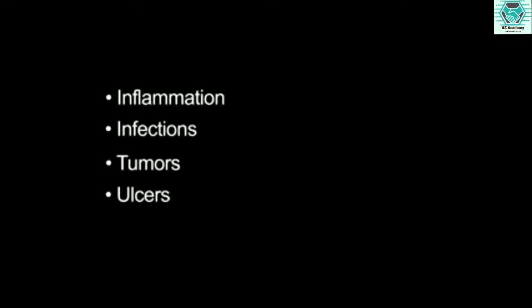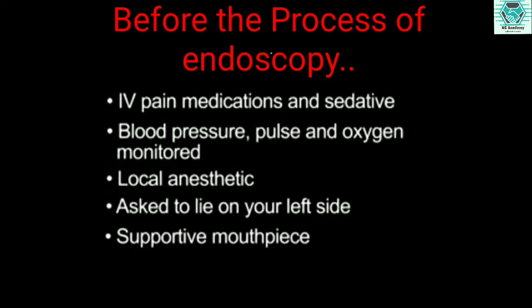Before the endoscopy procedure, IV pain medications and sedatives are used. Blood pressure, pulse and oxygen are monitored. Local anesthesia is given, the patient is asked to lie on the left side, and a supportive mouthpiece is also given.